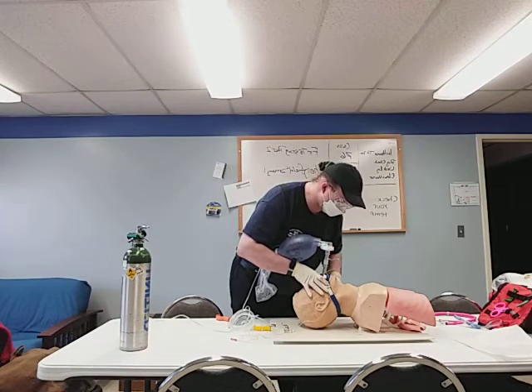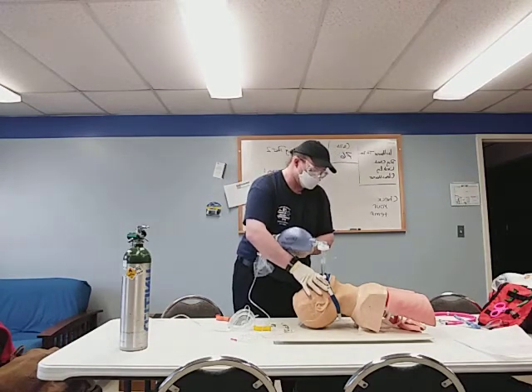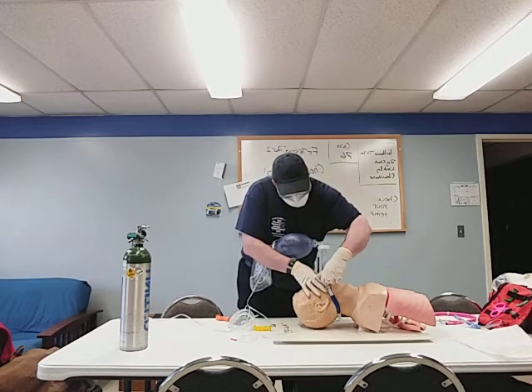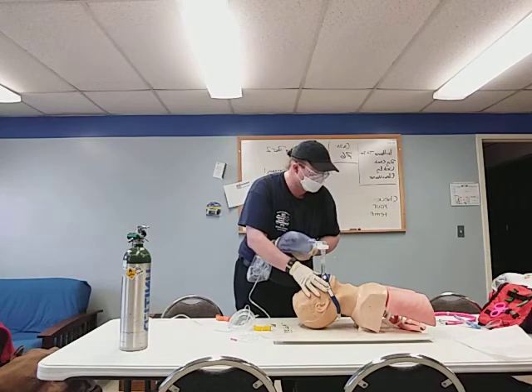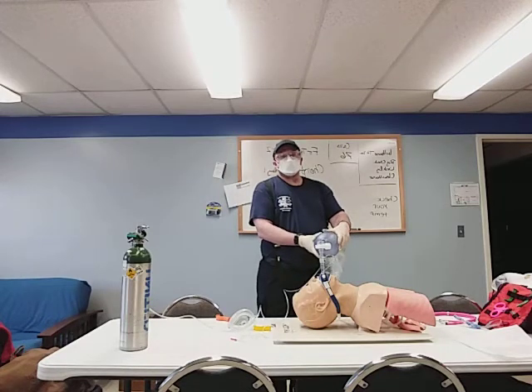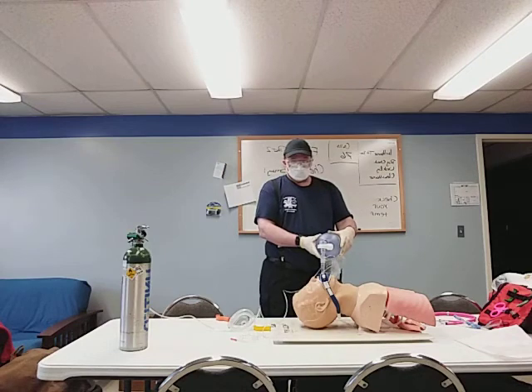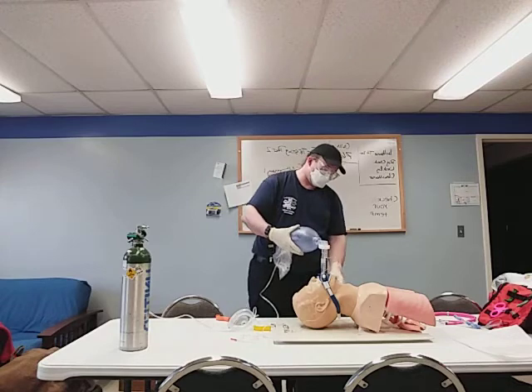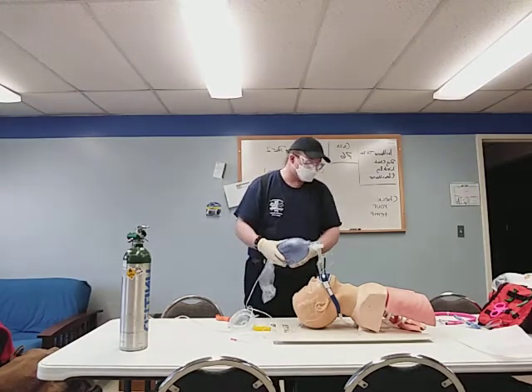Really, I need to be careful not to squeeze too hard or too fast during ventilations. Although with this airway, it's better because I have less chance of bypassing the trachea and putting air into the stomach. But you want to be gentle. All right, I believe my tube is secure.